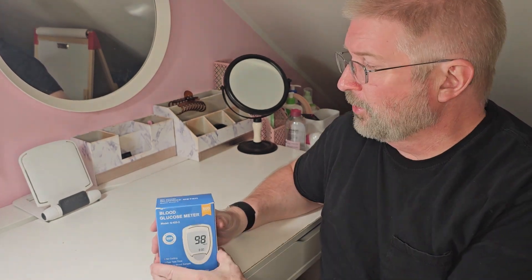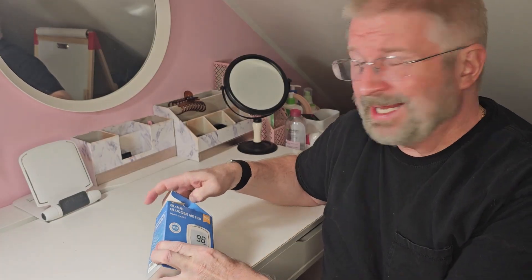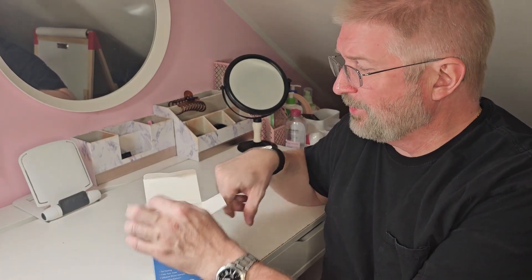Hey, Brian from Garage Mall. Today I have this blood glucose meter, so let's open it up, see everything that we get, and go through the steps on how to use it.